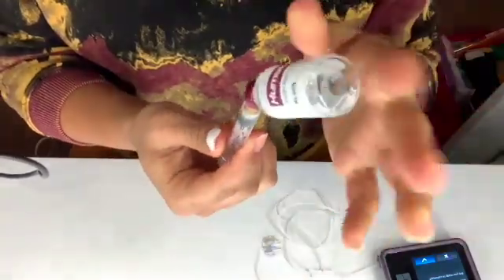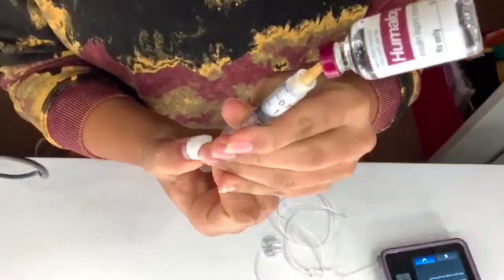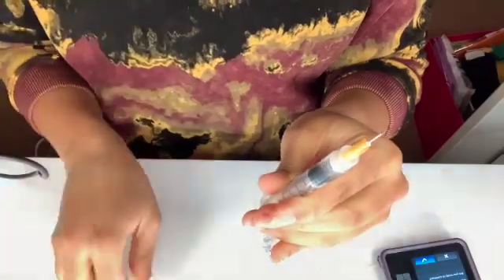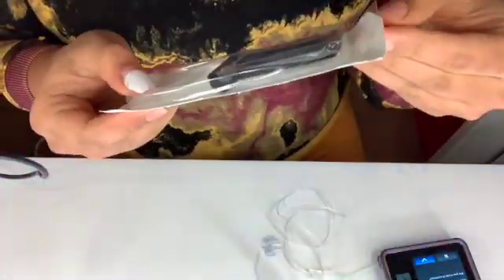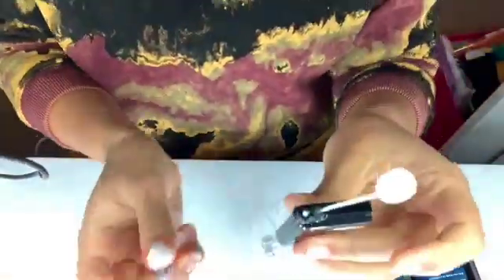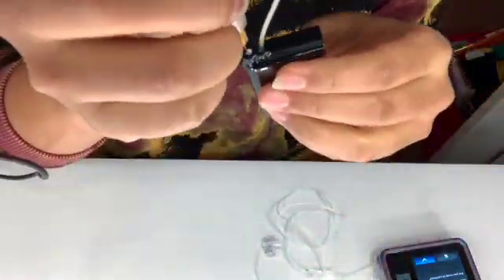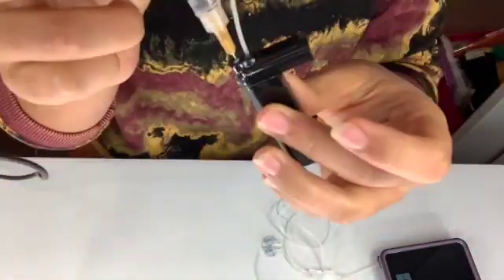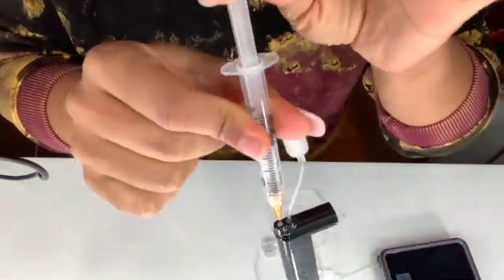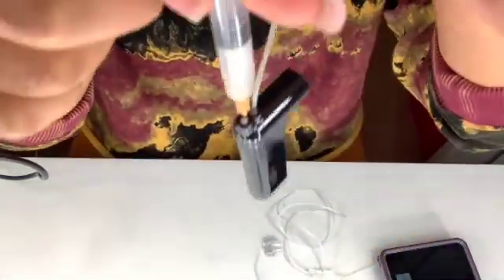Then you're going to put your vial of insulin on top and push in a little bit of insulin. Don't worry about getting the bubbles out right now, because right now we need to make sure we get the air out of the cartridge. So we're going to open the cartridge and see that little white hole right there? That is where you stick your needle in. So you put your needle in there, and then we're just going to pull up on the syringe and try to pull up as much of the air as we possibly can from the cartridge.